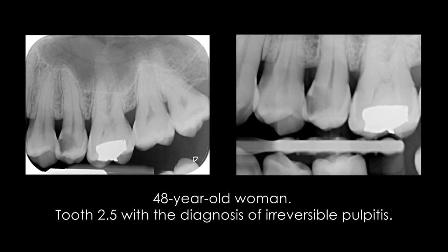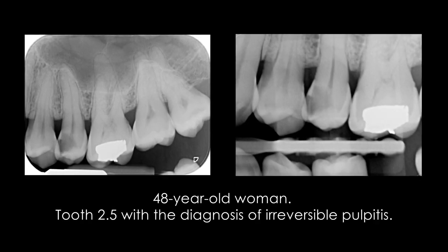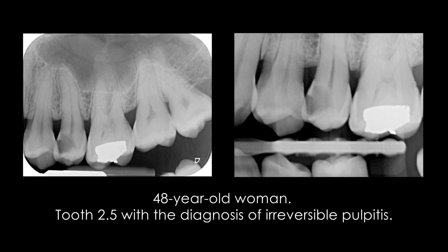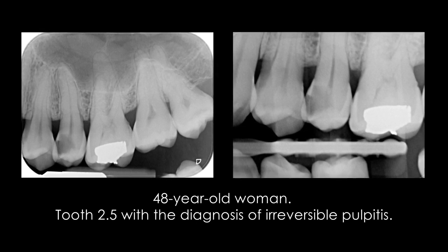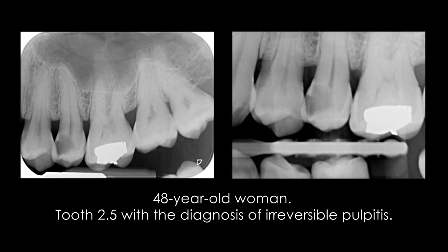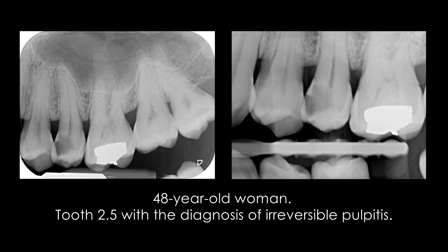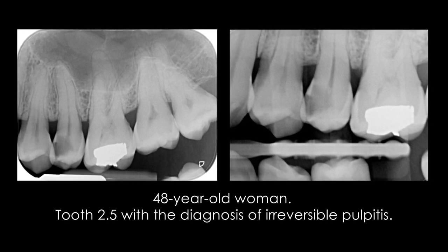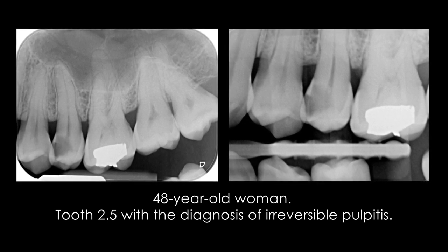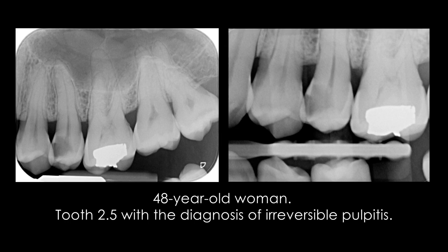This patient presented declaring severe sensitivity to cold and sweet stimuli, and some episodes of moderate spontaneous pain. Radiographs show a large mesial caries on the maxillary second premolar, penetrating the pulp space.